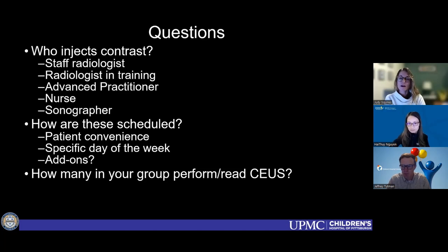And do you only do them a certain day a week, or do you offer them any day a week that the patient wants to schedule them? We basically say any weekday during business hours, 8 to 5, and only at our Anschutz and our Colorado Springs campuses. We have a couple of smaller satellite campuses where we have not started doing this yet, because I think that's a whole other logistical challenge. But at those two sites, just during weekday daytime hours.